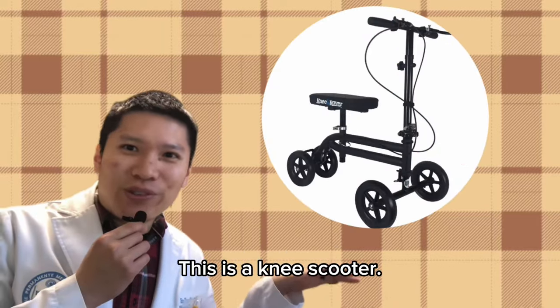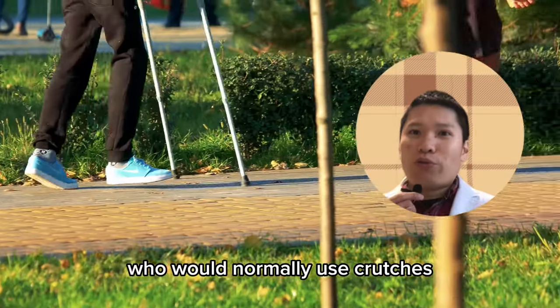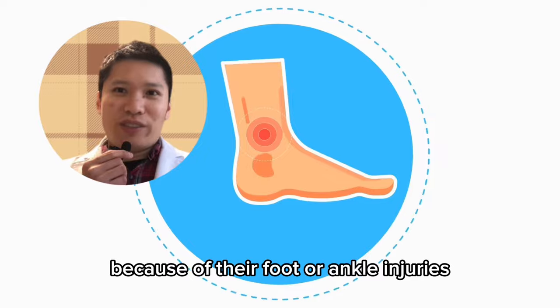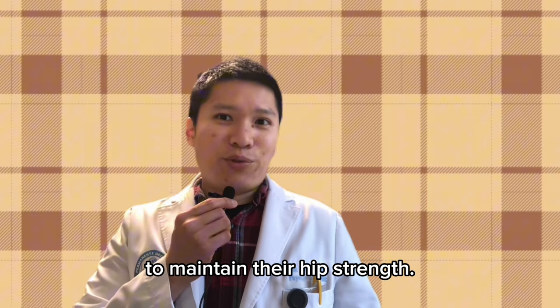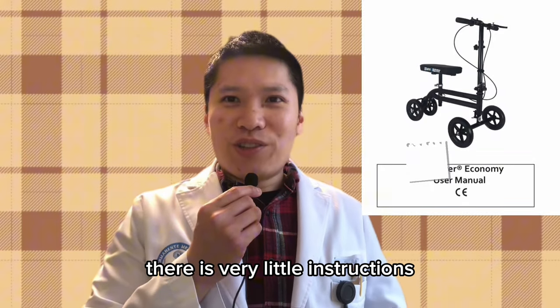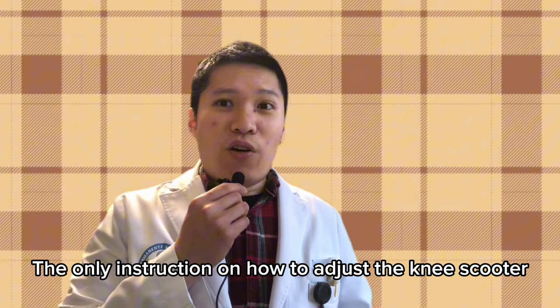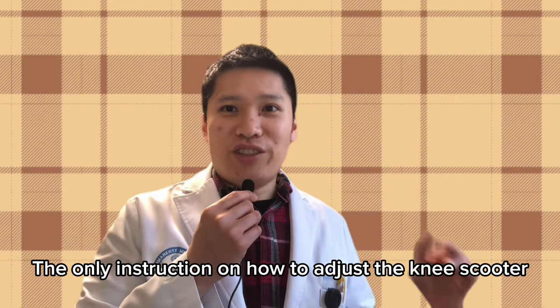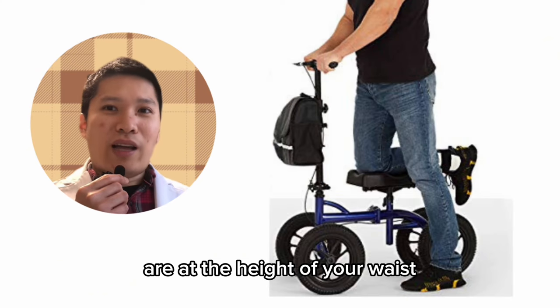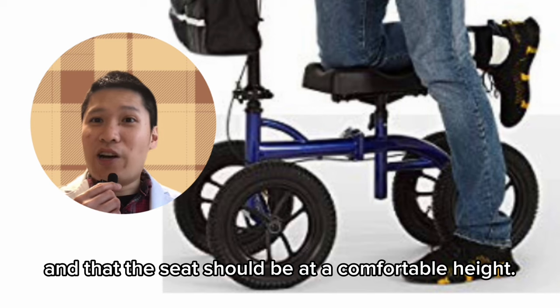This is a knee scooter. It is an assistive device that allows people who would normally use crutches because of foot or ankle injuries to maintain their hip strength. There is just one problem: there are very little instructions on how to adjust the knee scooter. The only instruction given is to make sure the handlebars are at the height of your waist and that the seat should be at a comfortable height.